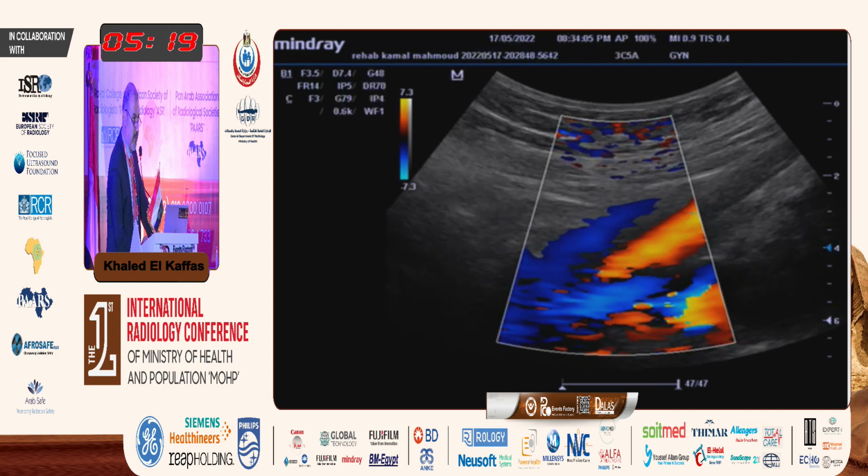When you find these parameters, we are confident to diagnose an ovarian vein reflux. Many of us, when they find only dilatation without detection of flux, go for pelvic congestion, and it gives a misleading effect to the clinicians, because when we find para-ovarian varices, maybe there are other causes, not always the left ovarian vein. So we need an evident reflux and dilatation of the vein to reach this diagnosis.